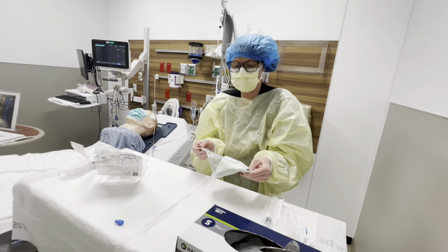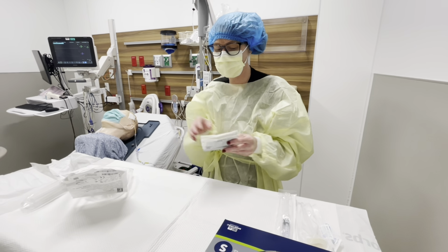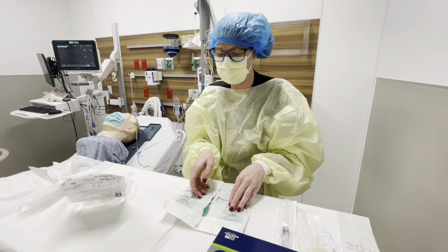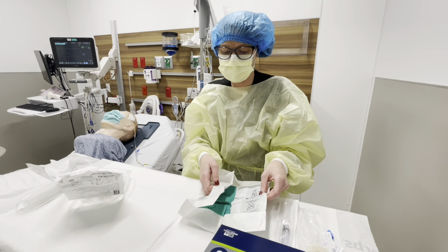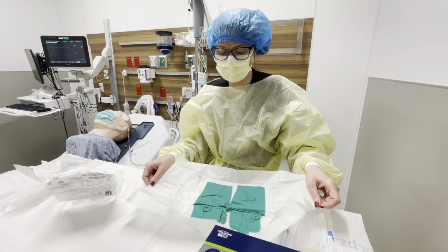Our sterile gloves. And some people like to use their gloves as their sterile field. That's fine. I like to use the transducer kit. As long as you're making sure that your equipment remains sterile, it's not really that important where it ends up being. It's just that you don't touch a bunch of stuff with it.